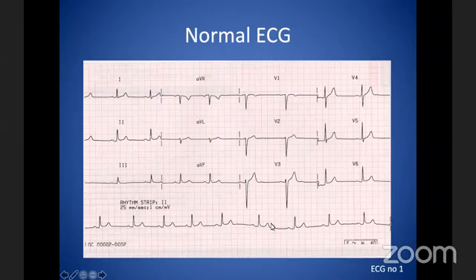A sinus arrhythmia, slight irregularity. But overall the heart rate is regular. Heart rate is 60. Do you all understand how I've calculated the heart rate? So if the next QRS complex was here, the heart rate would be 300. If the next one was here, it would be 300 divided by 2, 150. If it was here, 300 divided by 3, 100. If it was here, it would be 75, 60, 50, 40 something, and so on.